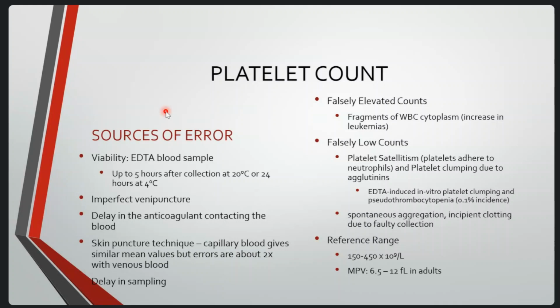In here, the platelets will adhere to our neutrophils, and also this clumping can be due to agglutinins. Throughout my practice, I have only seen once this in vitro induced platelet clumping.